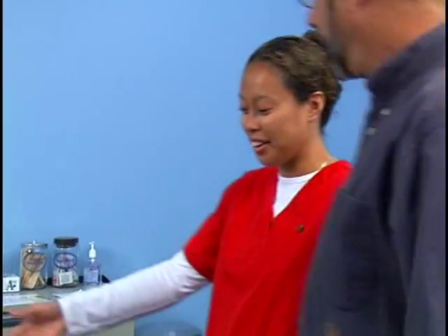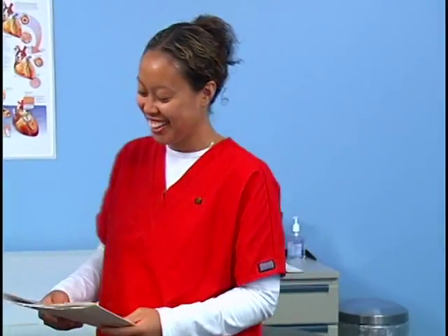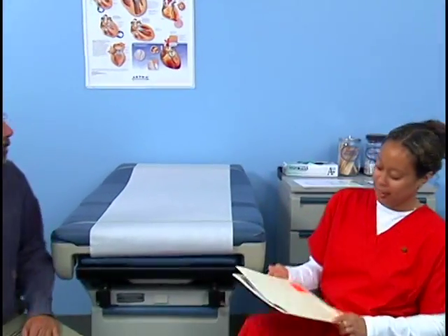Greet the patient and introduce yourself. Identify the patient and explain the purpose of the test. Explain to the patient that he will be collecting a stool sample on 3 different days. Tell the patient not to collect a stool sample if there is visible blood in his stool or urine. Tell him that the test should not be conducted when hemorrhoids are bleeding or if he has a urinary tract infection. This is because bleeding from other sources can cause a false positive test result.